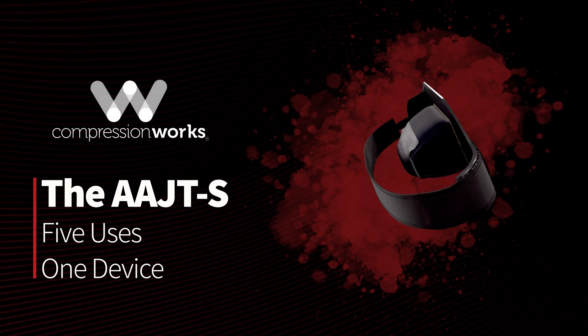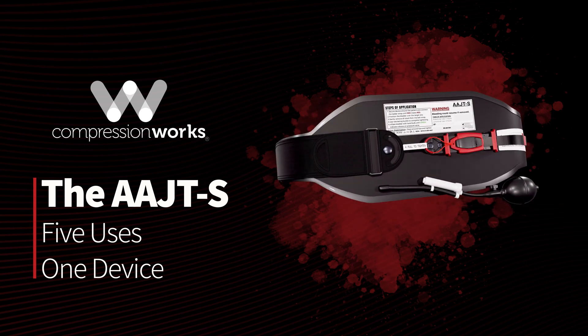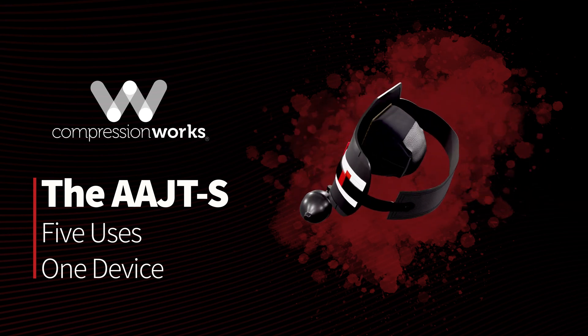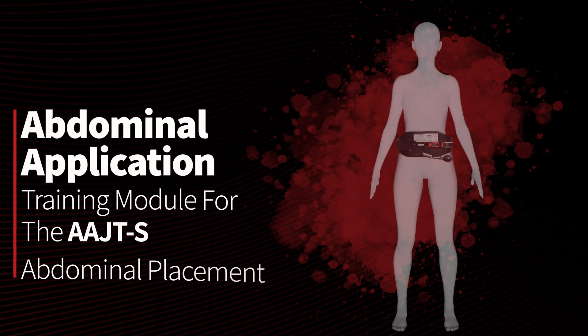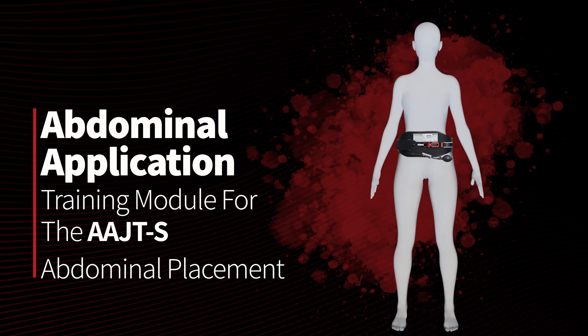The Abdominal Aortic and Junctional Tourniquet by Compression Works delivers complete occlusion of blood flow to critical areas such as the upper extremities, lower extremities, and the pelvis. This training module will take you step by step through the abdominal placement of the AAJTS.